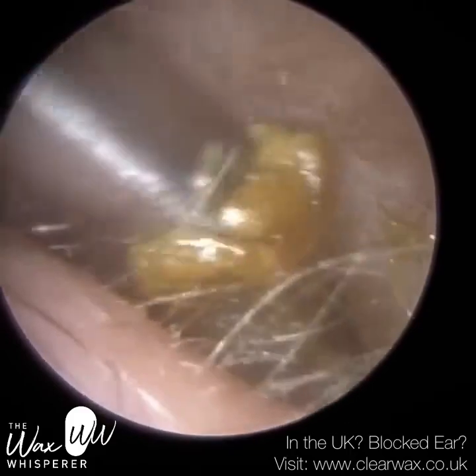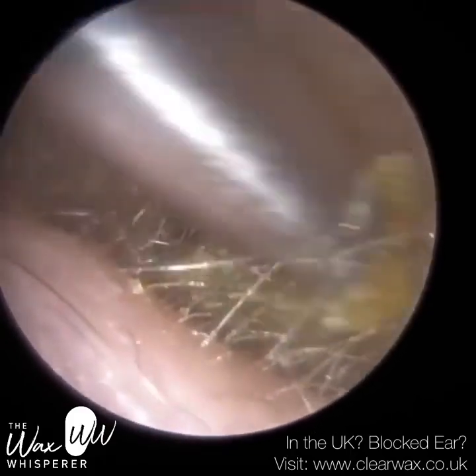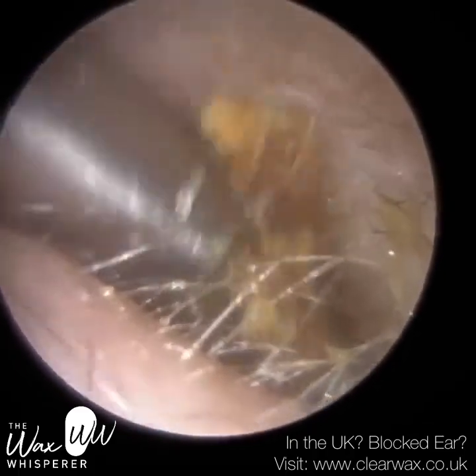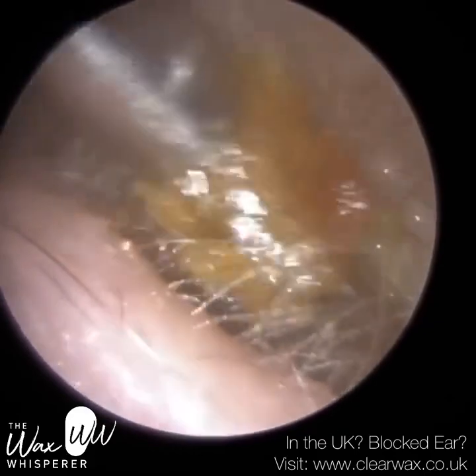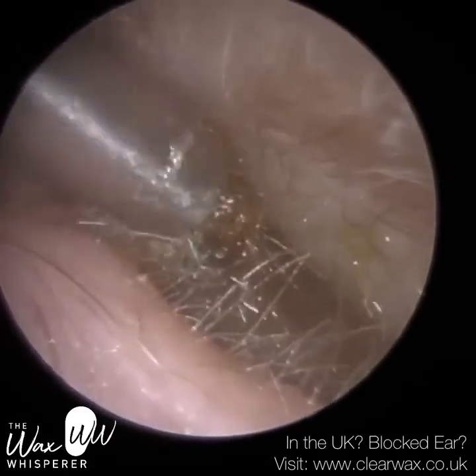And in this particular case, this plug of wax and dead skin had formed, but it failed to migrate, and it could be in part because they've got a narrow entrance to the ear, so the plug itself physically wasn't able to come away. And the term microsuction, some of you may be wondering, why do we call it microsuction?